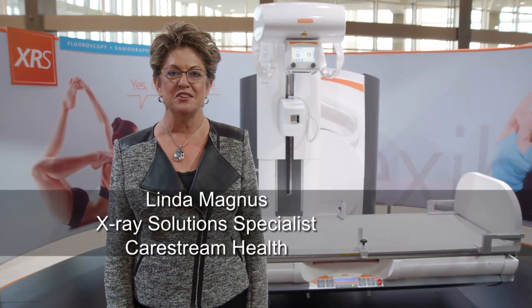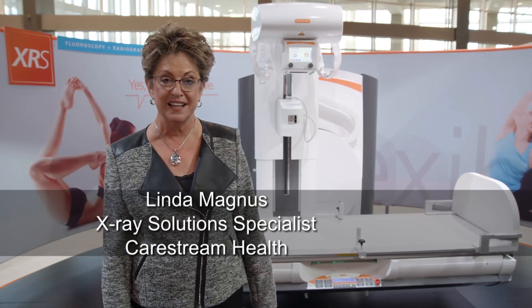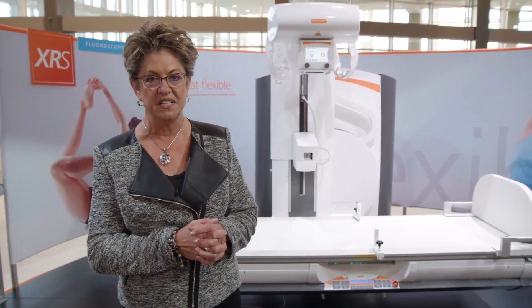Hi, I'm Linda Magnus with CareStream Health, x-ray solution specialist. Thanks for joining us today and taking a look at our DRX XL Plus, a totally flexible solution for both radiography and fluoroscopy in one complete system.